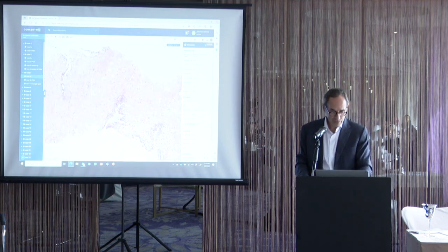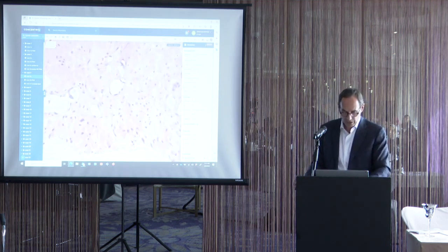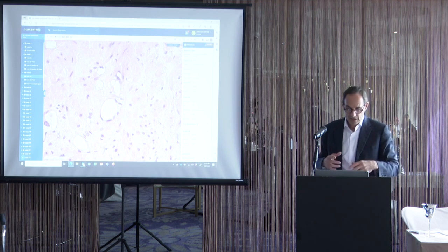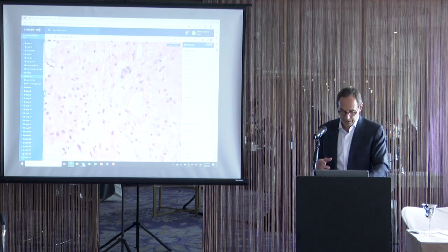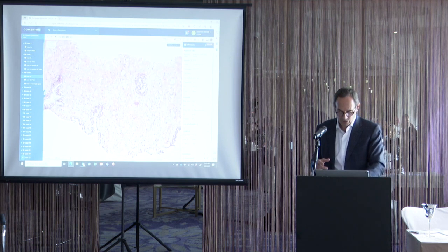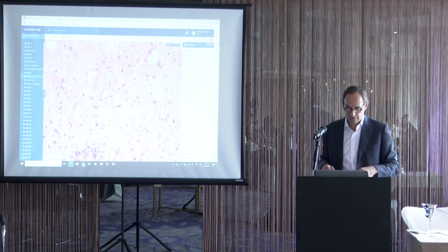But sometimes cancer that has responded well to radiation doesn't look like usual prostate cancer. And what they often have is, first of all, very atrophic glands. They often have vacuoles in the cytoplasm. The nuclei often look very pyknotic and not overtly that malignant. But architecturally, they're abnormal. This is not a normal architectural pattern of benign glands.